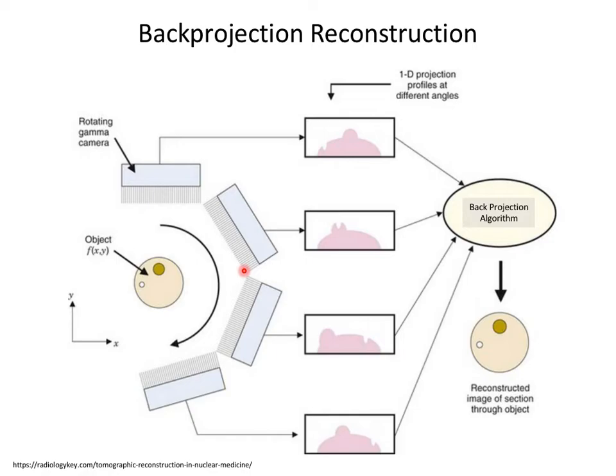What's the downside of just putting more stuff in? It's radioactive, so it's going to get absorbed, and when it gets absorbed, it does some damage. So there's not an open ceiling for just putting more and more of this stuff in. You need to look at what the radiation dose is to the patient. You want to keep that at a reasonable level while you're making this picture, and that's pretty well what determines how much stuff you can put in.